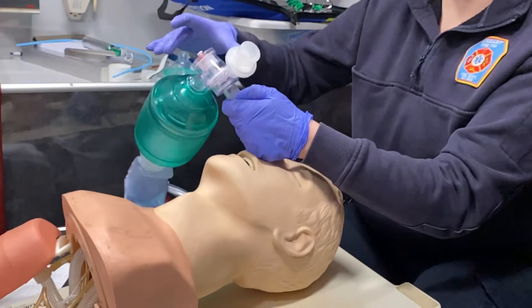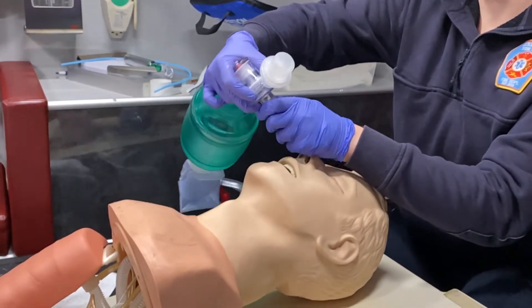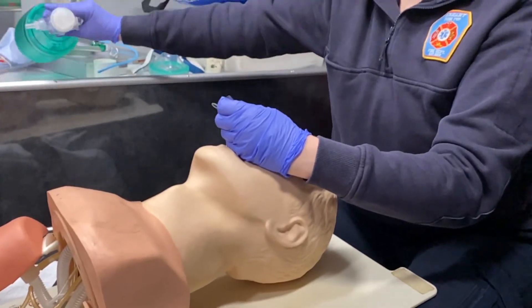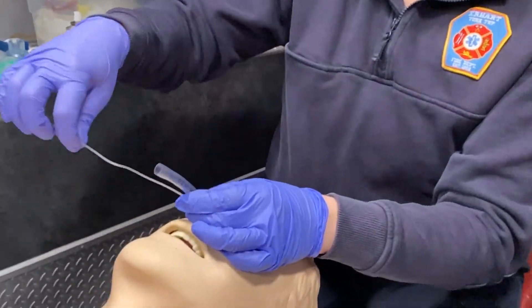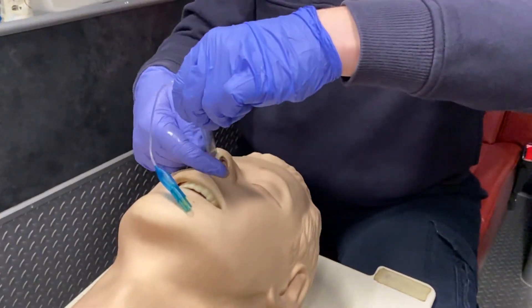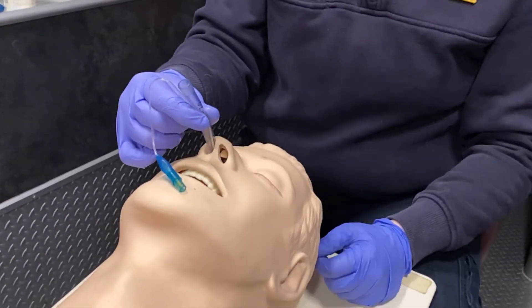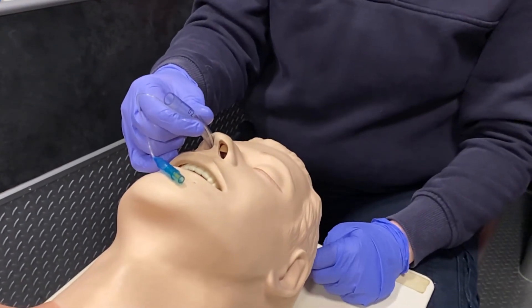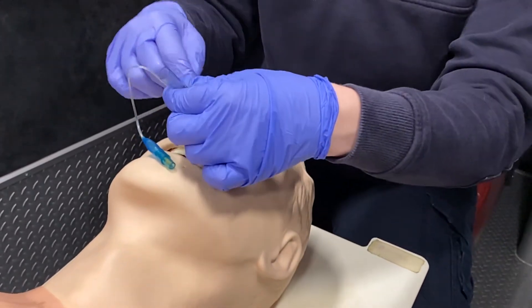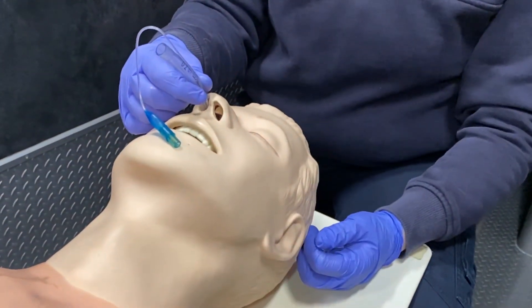Now you can't secure this with your commercial tube device, so you would have to get a little creative. What we could do for this patient is take tape, wrap it around the tube, and then tape it to their face — that would probably be the best way. You do want to secure this somehow, probably using a lot of tape to secure it to their face, kind of like you would an NG tube.